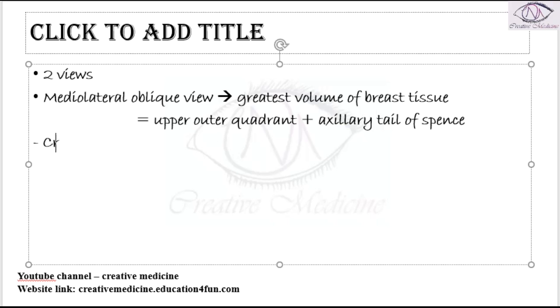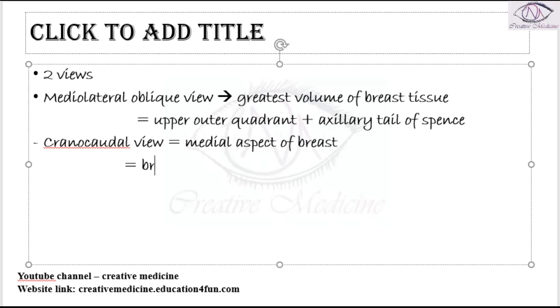Then the second is the craniocaudal view. The craniocaudal view mainly allows visualization of the medial aspect of the breast, and this craniocaudal view shows greater breast compression.